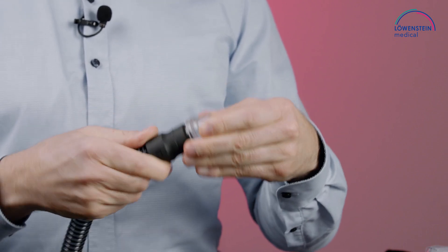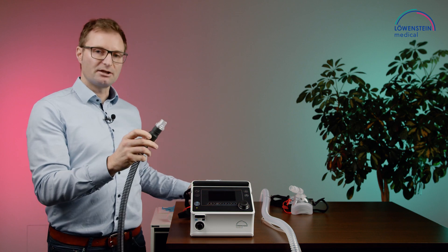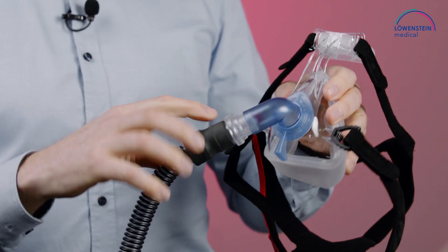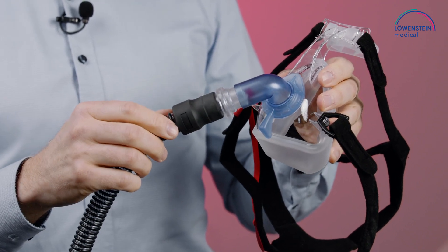You put the exhalation system onto the circuit, and the circuit and exhalation system onto the non-vented mask. Now we can get rid of the CO2 via our exhalation system.